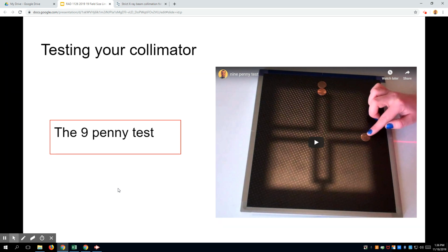So before we get to this, have we been collimating? And how do you know you're collimating well? Same size, from up to down or side to side. So you have four sides. Yeah, each one the same. But it's also four sides with the anatomy that's of interest, right? You don't want to have an image pop up and look at it and just say, oh, four sides. You don't want to just focus on the borders, right? You have to go a little bit beyond that.